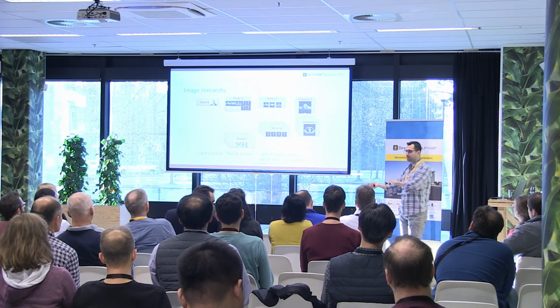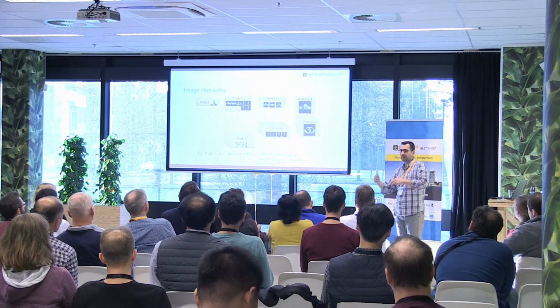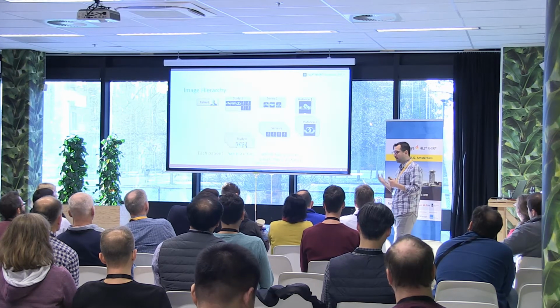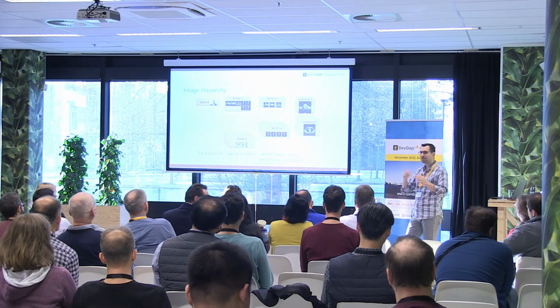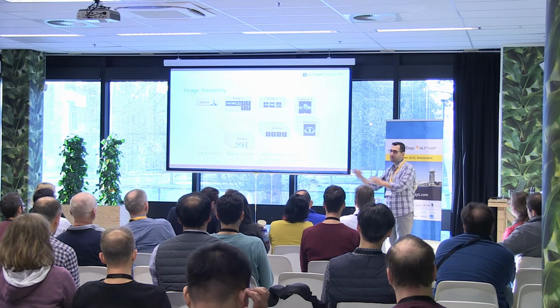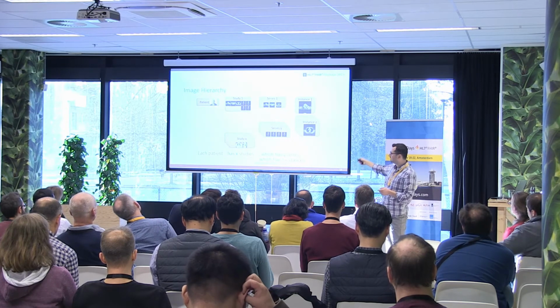So, for example, if it's a problem with your hand, they may decide to capture multiple views of your hand, but then maybe capture something else. Okay, so the example of hand maybe wasn't very good. Let's take an example of a CAT scan. They may order a multi-protocol CAT scan, or maybe even multimodality, like a little bit of a CAT scan with an X-ray or something like that. So each one of these would be a series, and then within the series you have the instances.